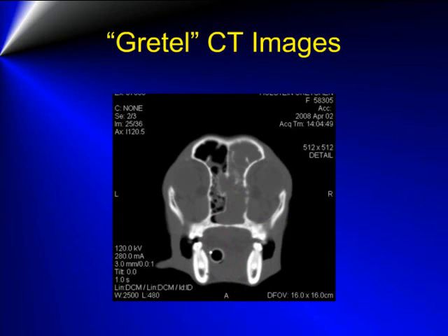In this slide, note that there is a large amount of tumor tissue that appears to be invading into the nasopharyngeal region, as seen by the pink arrow. The blue shaded area represents the position of the olfactory bulb, and in the right ventral aspect of this area, there is not a normal delineation of bone surrounding the olfactory bulb, which is highly suggestive of invasion of the tumor into the olfactory region across the cribriform plate.